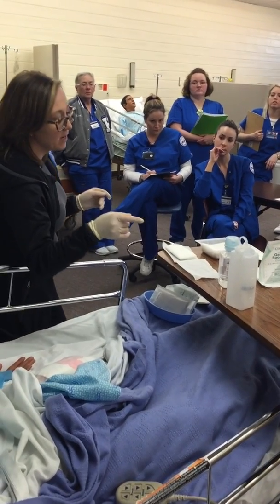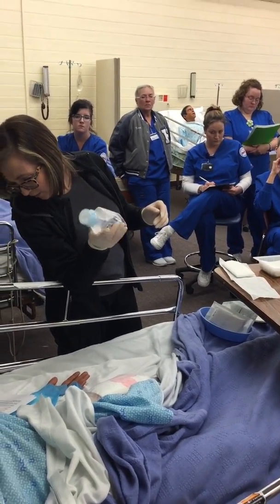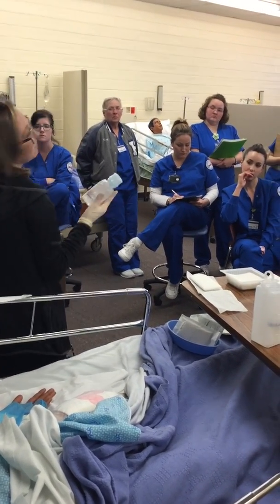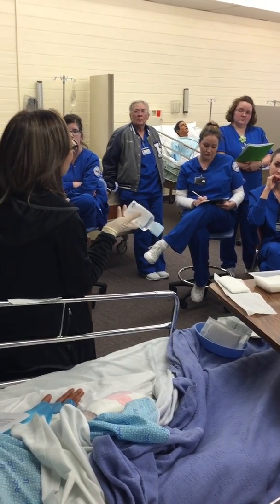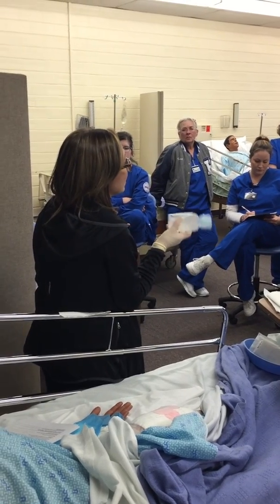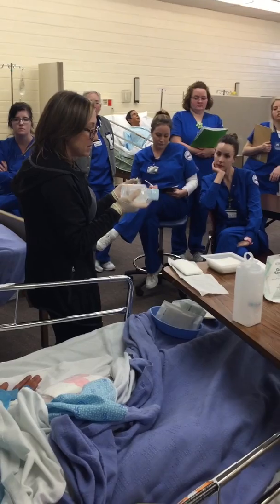So next I'm going to go ahead and lip this. I think if you're going to use this, you have to lip it if we're going to do irrigation. So you're going to lip it. Make sure you have the prescribed solution. Sometimes you'll see Dakin's ordered, which is kind of like bleach. Sometimes saline, sometimes bicarbonate, just whatever they want to do. So this is going to be saline, so I'm going to take this.